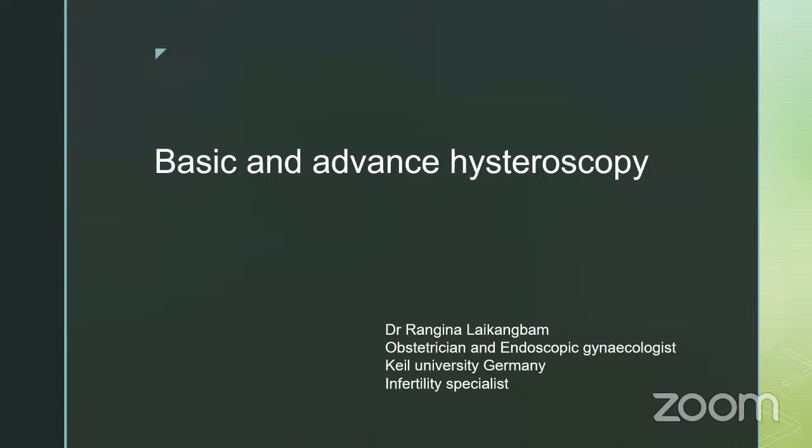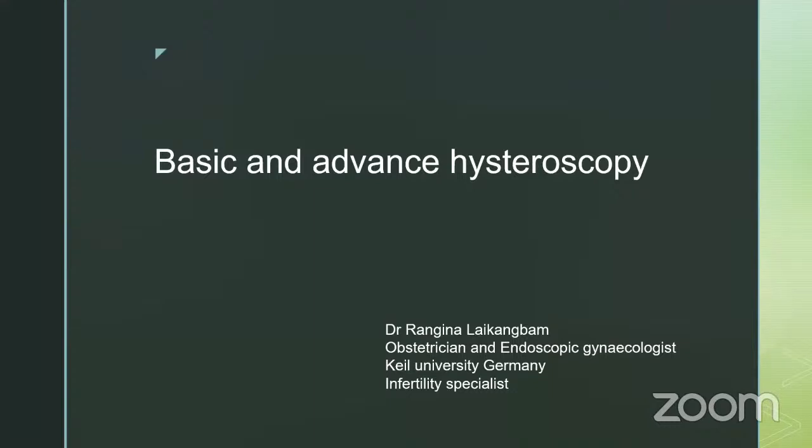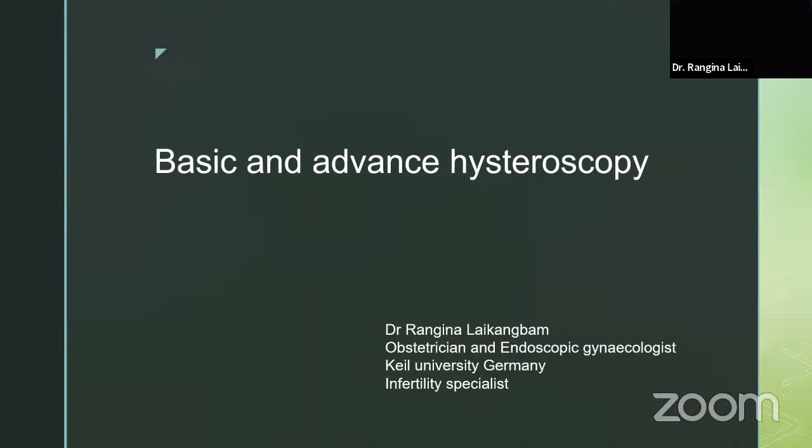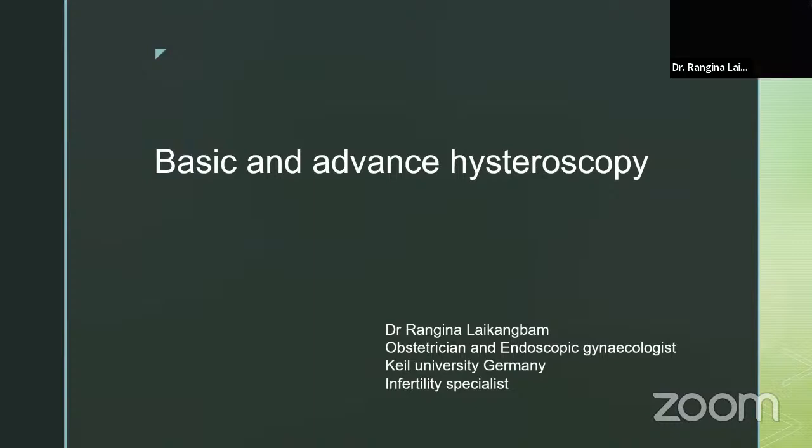But in these cases, I recommend doing the hysteroscopy in a tertiary care center, where there is an ICU setup. Yes, that is very important, not in a small setup. Because these days, every day we are reading about something coming up medico-legally. So even though our center is fully equipped, we prefer to do these types of cases in a tertiary care center where the facility of ICU must be there. Very true.